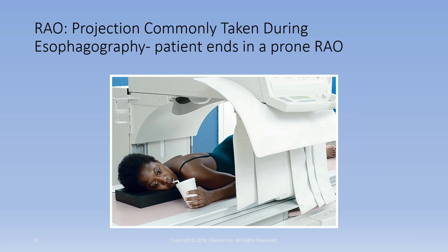They do reference in figure 12.68, which this is similar, different model again. These are the lead drapes that they were talking about that are 0.25 millimeters lead equivalency. This right here is the Bucky slot shield. The patient has the fluoro tower over the top of them. That can come down closer to the patient. Once the radiologist starts, they can lower that so that it's closer to the patient. And they reference that in an RAO, a lot of times the patients end in this position before the radiologist or the fluoroscopist hands the patient over to us to get our overhead images.